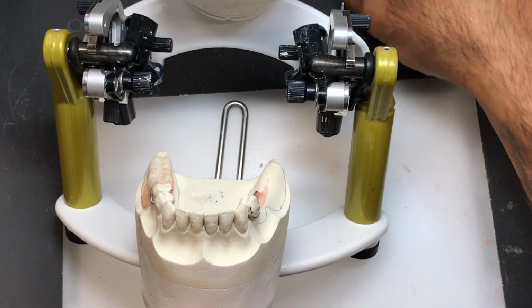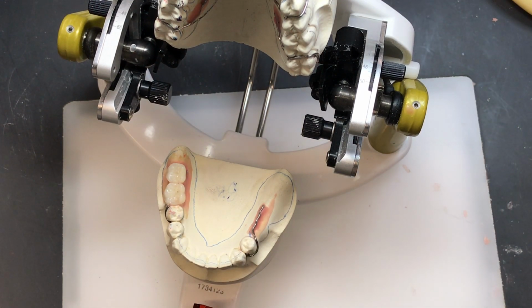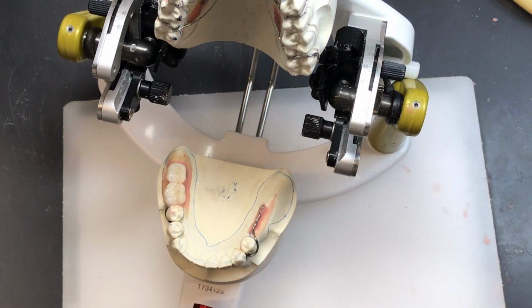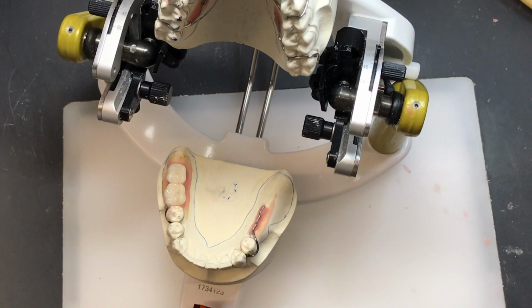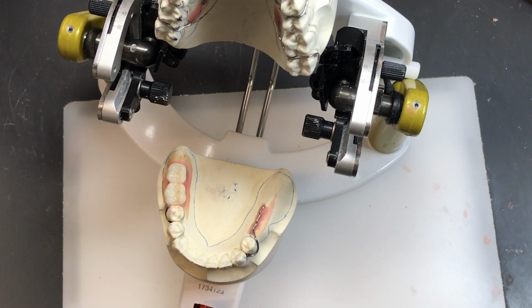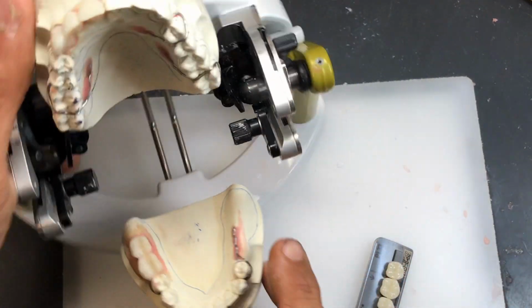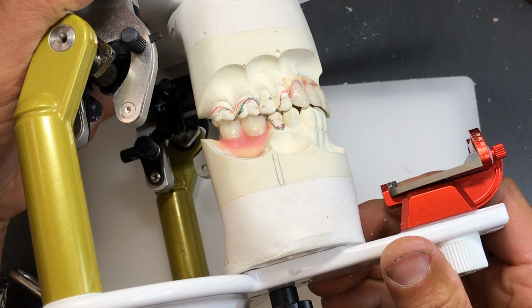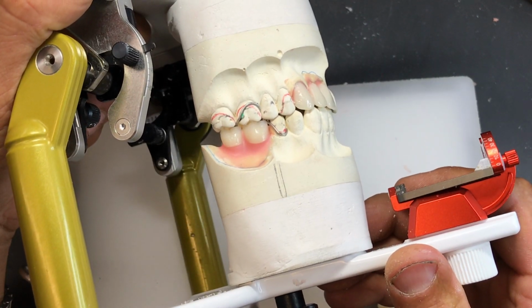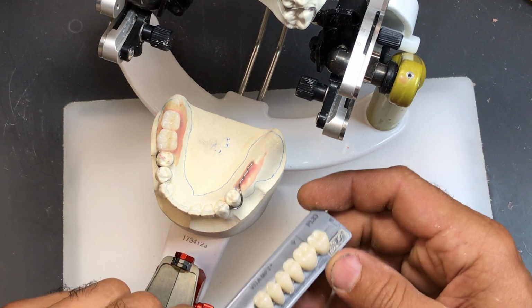So obviously we're going to introduce the second bicuspid. Just want to get a little more lighting here for the video. So we're going to introduce the second bicuspid, and as you can see from the other side, we have pretty good interdigitation between the teeth, or intercuspation. And that only happens when you select the proper mold that will fit up against the opposing.